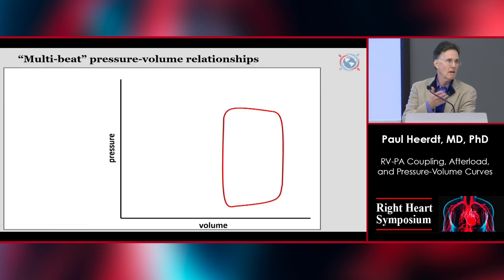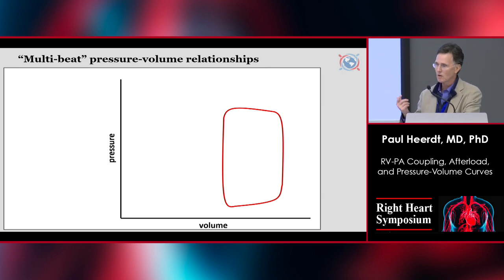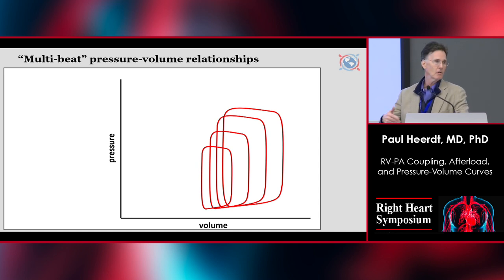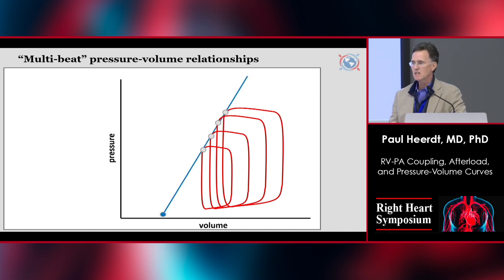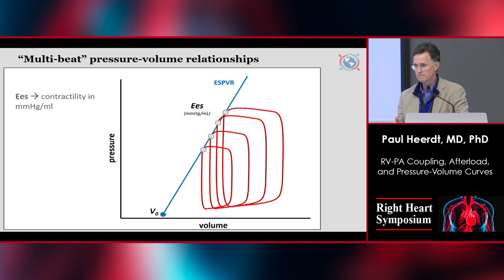Every cardiovascular textbook that you read talks about pressure-volume relationships being the reference standard for systolic and diastolic function. And this is an example. So the classic way of doing this is we take a PV loop, we then reduce the preload somehow with caval occlusion or a Valsalva or something. We regress the upper left-hand corner of that. It gives us the end-systolic pressure-volume relationship. There we go. And it gives us the V0, or the volume that theoretically would be left when the ventricular pressure goes to zero. The slope of this relationship, as we've heard before, is regarded as end-systolic elastance, a load-independent metric of contractility.